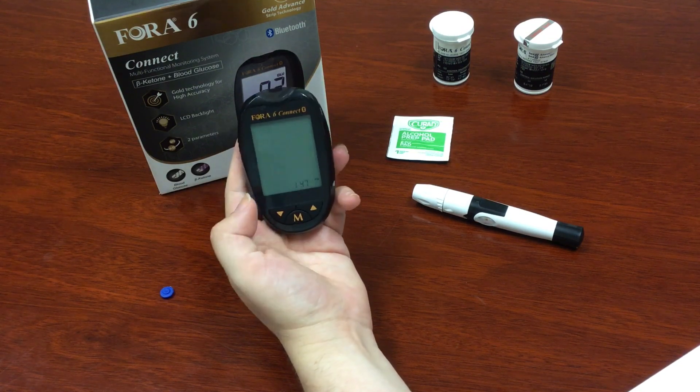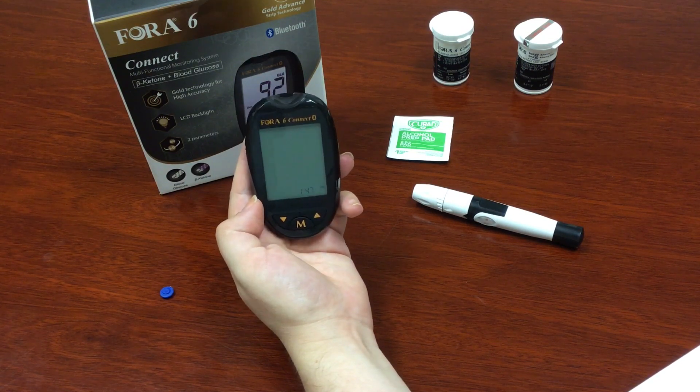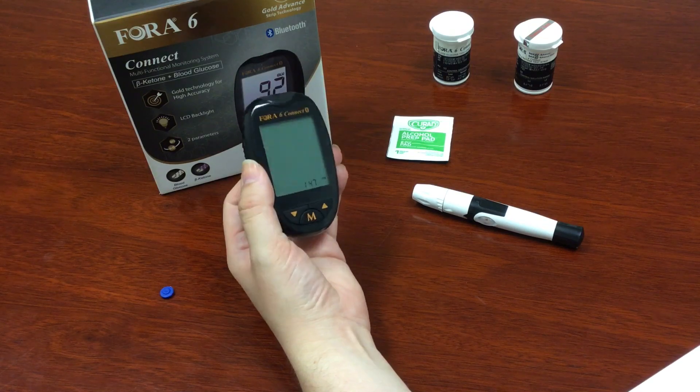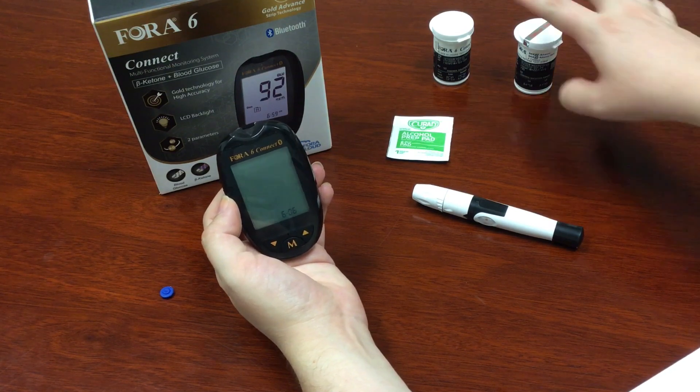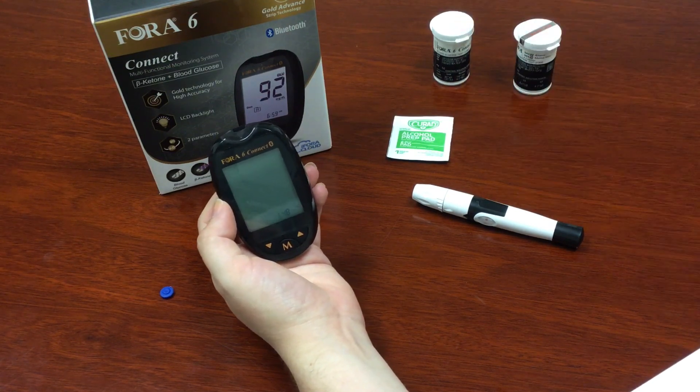I'm using a 406 Connect because it can measure both glucose and ketone levels in one convenient device. I've also got the lancing device already ready, as well as my ketone and glucose test strips right here.